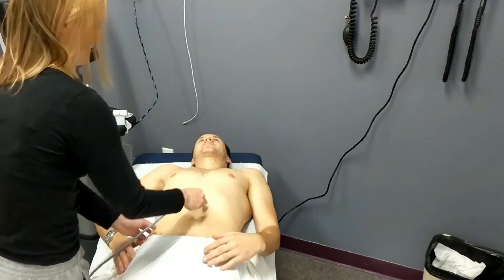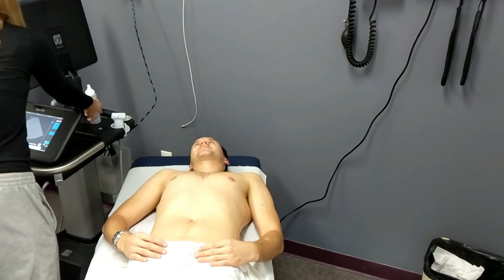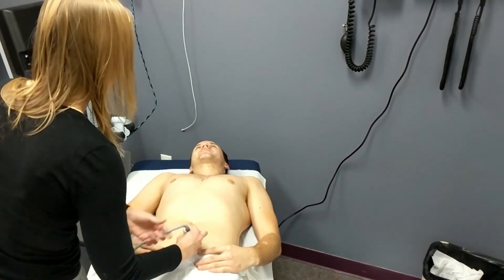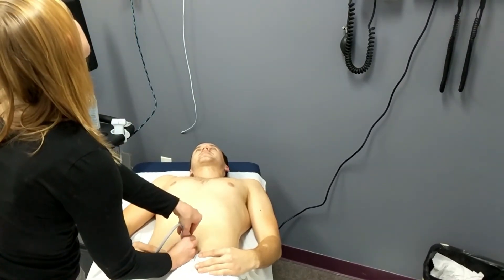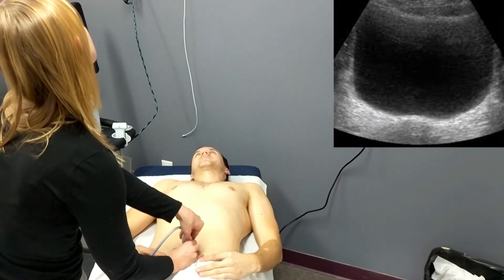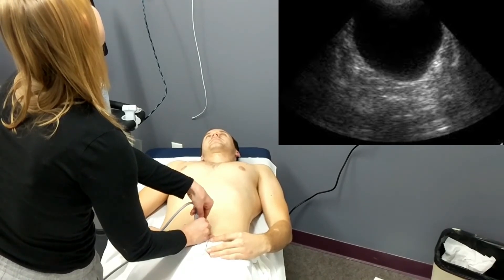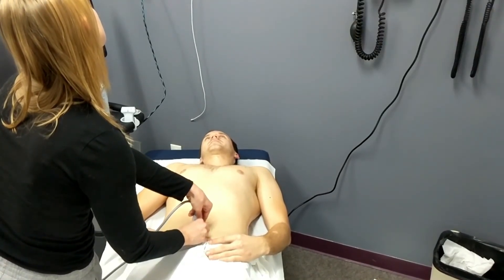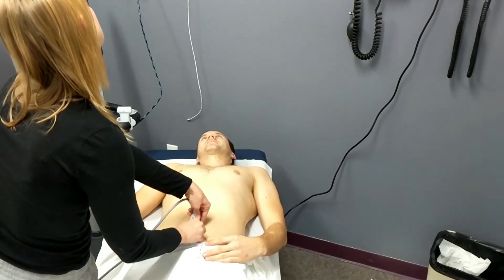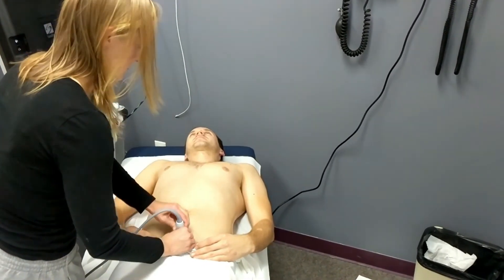Once she has completed that assessment, she will move on to the suprapubic region of the FAST examination. She will take the transducer all the way to the patient's pubic symphysis and look at the bladder in both the long axis and the short axis view. She will both rock and fan the transducer in order to fully evaluate for any fluid collections or abnormalities in or around the bladder and the surrounding anatomical structures.